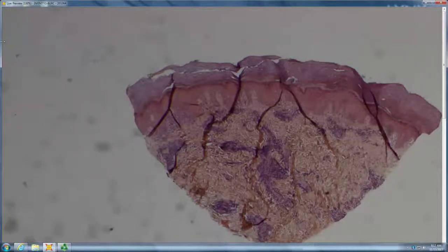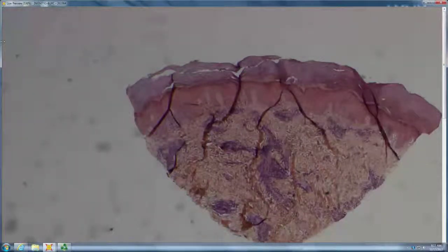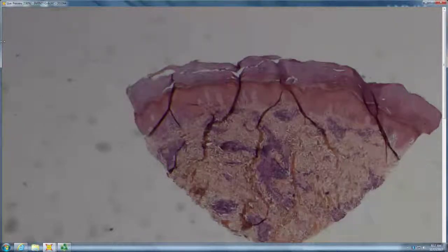So what caused the ulcer most likely, given that there was all this tufting too? Is that extravasated red? There's lots of extravasated reds. So probably like stasis change. Yeah, so this is all stasis change, probably a stasis ulcer.